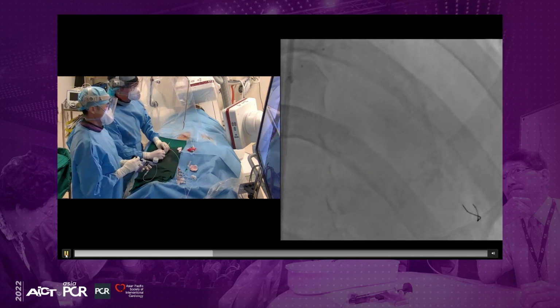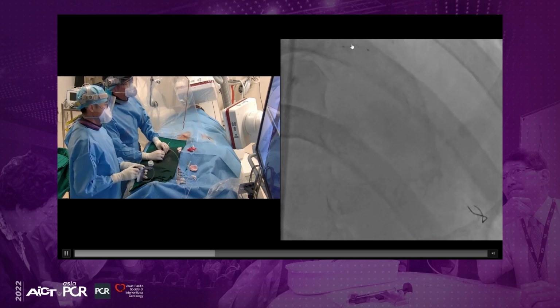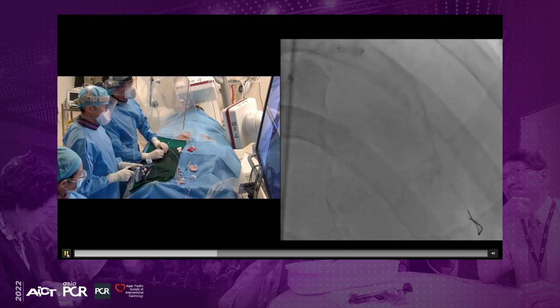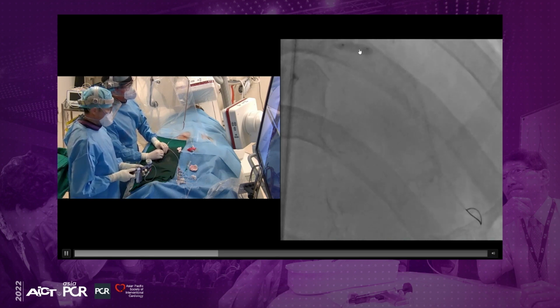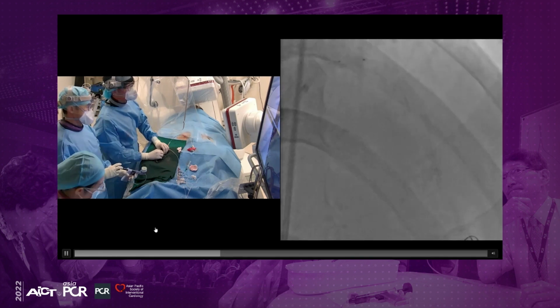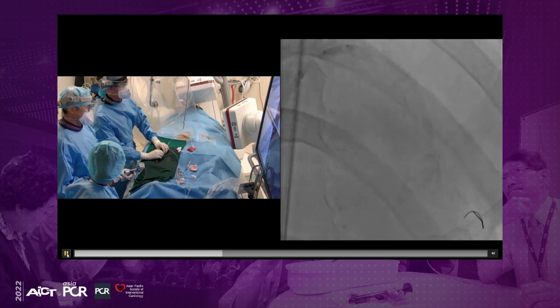Yeah. So we also went with another cutting balloon because we didn't have the available size for the Wolverine. We used a 3.5 Lacrosse. And this again was inflated to the rated pressure, and there was no obvious waisting seen.